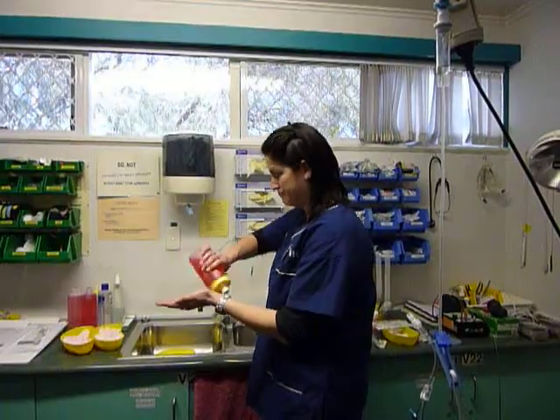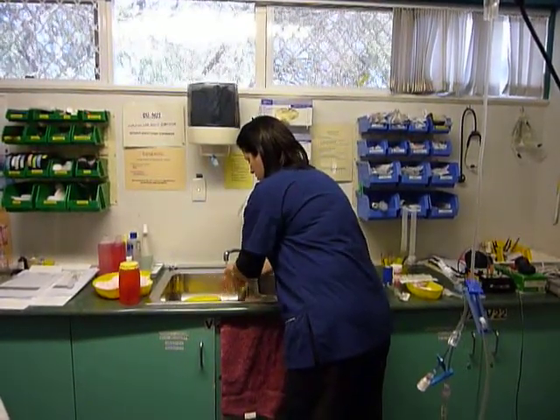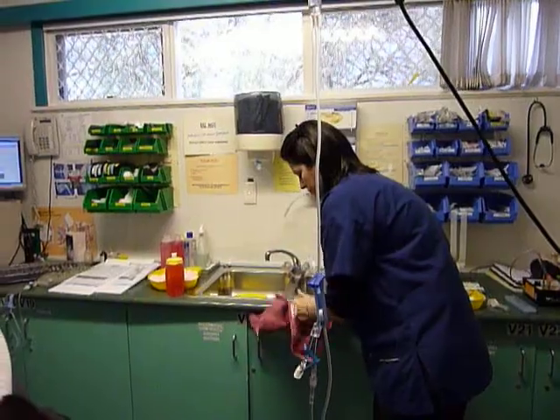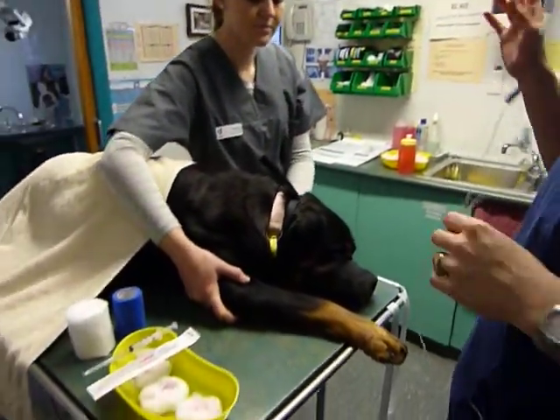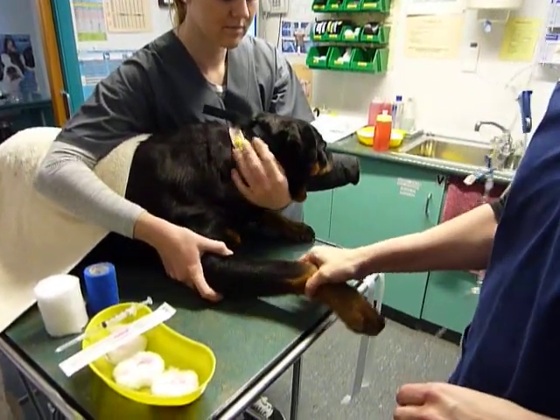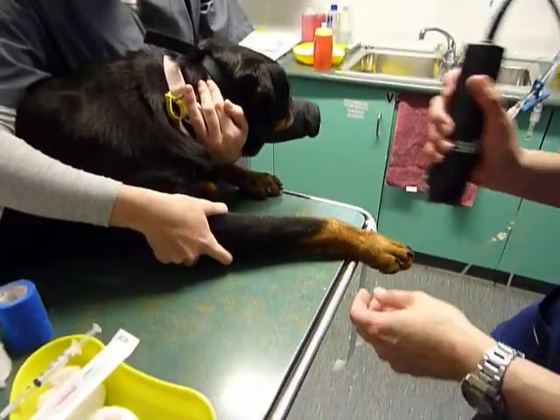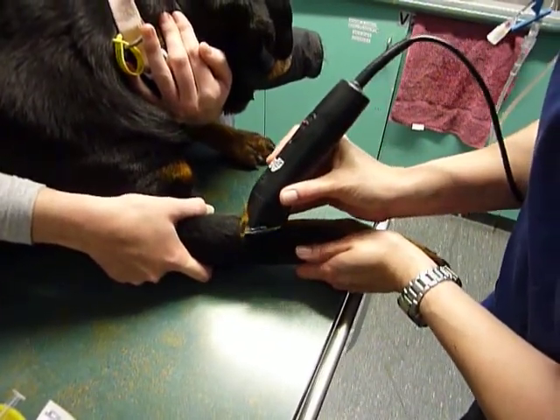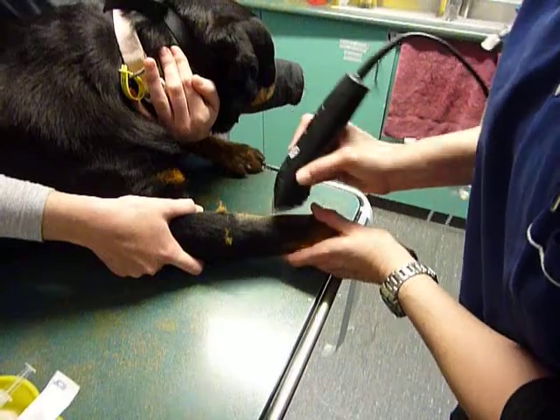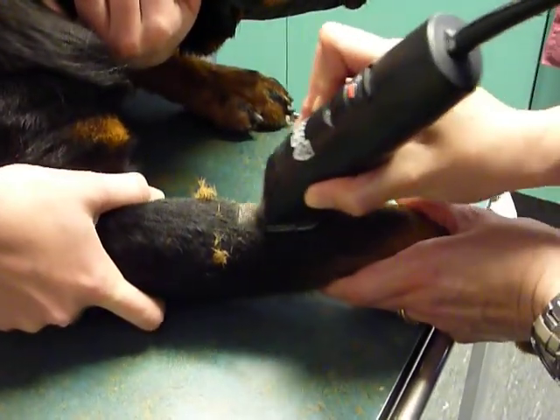The key to your catheter is to wash your hands. Your veterinary nurse is going to restrain the patient and extend the right foreleg, exposing the cephalic vein. We are going to clip over the top of the cephalic vein, always clipping enough to give you a sterile site. Don't be stingy about your clip.